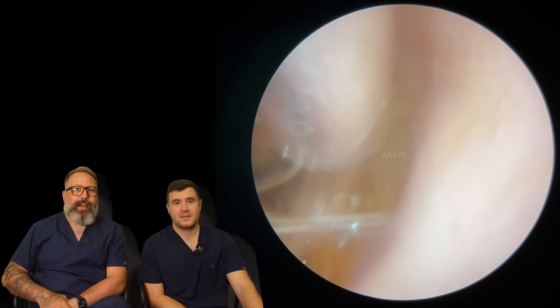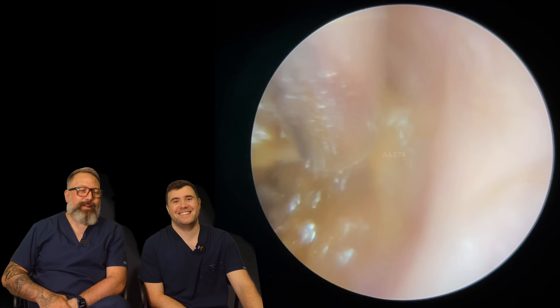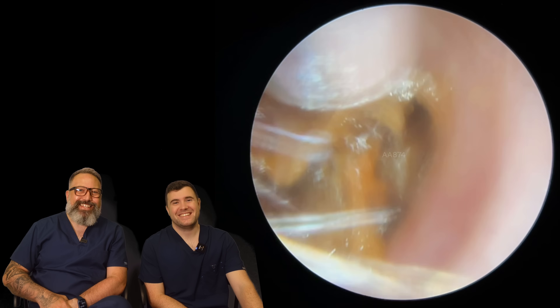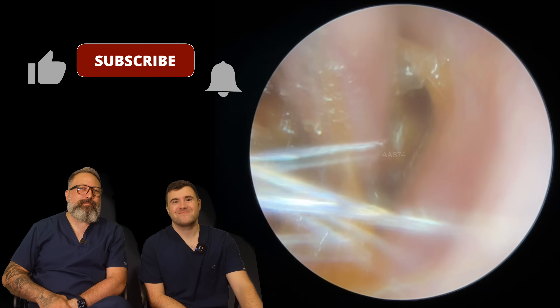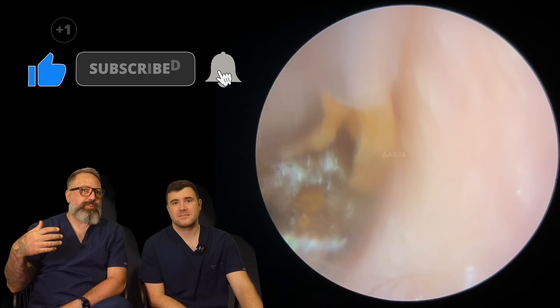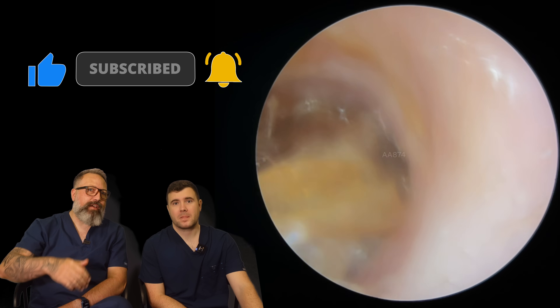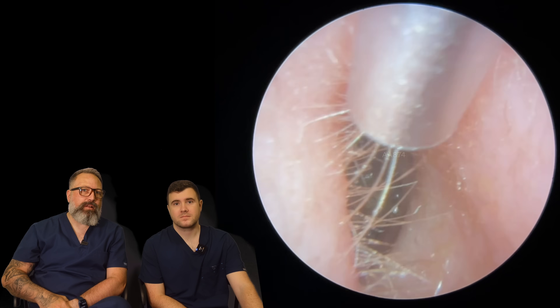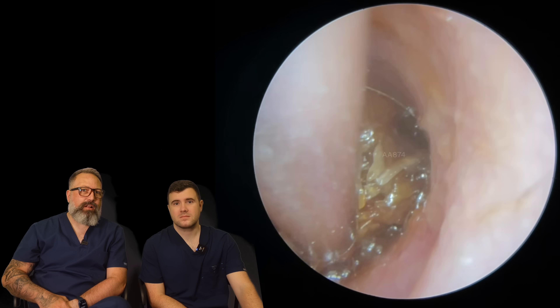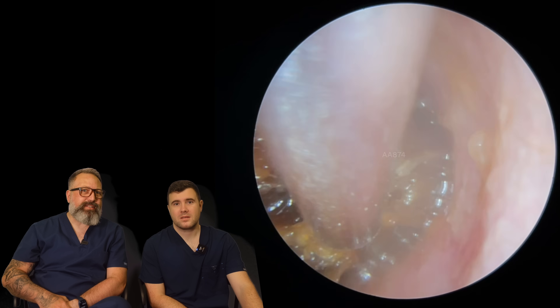So this is my patient today — you've got a runner, Taylor. You've got a couple of mine, a couple of yours, haven't we? I've never seen mine. So this is a really wet and mushy type of surface to this wax. Now this happens a lot when patients have used drops. You can see a little bit of keratin there coming away from the canal wall. But we've got this much harder lump in the middle here, sort of a harder nugget of wax. Quite deep though, this one.